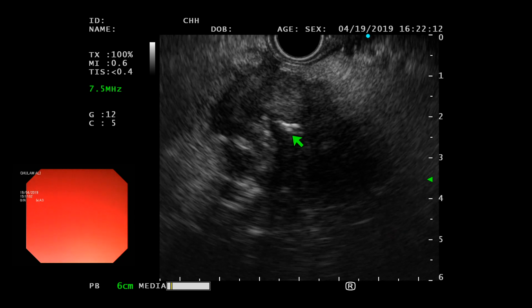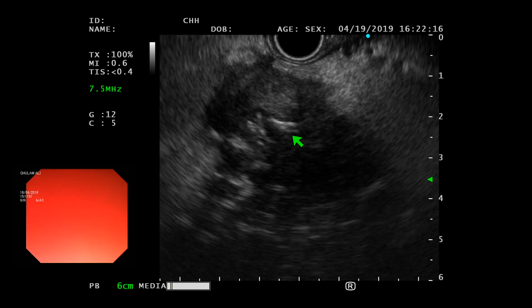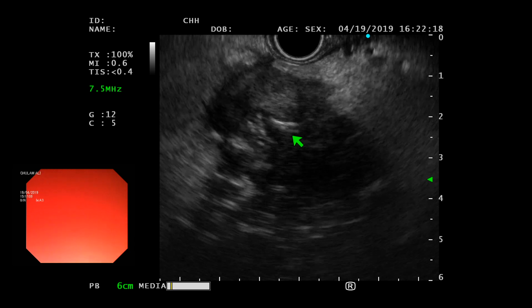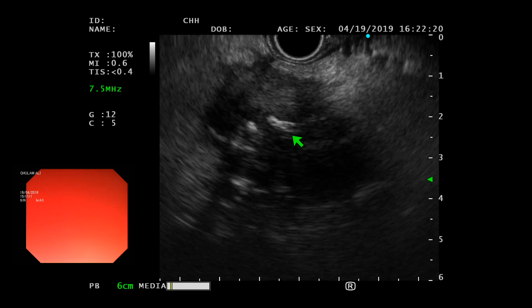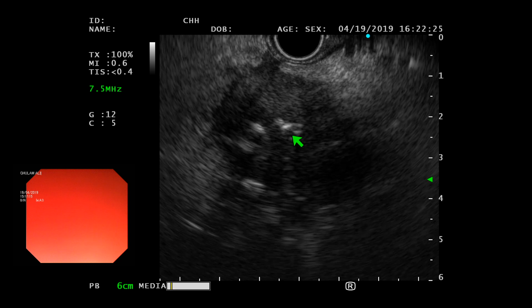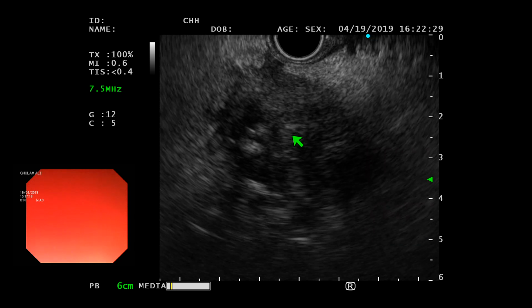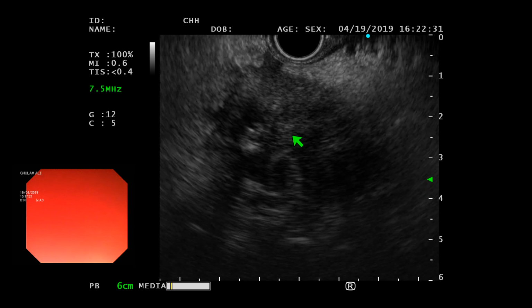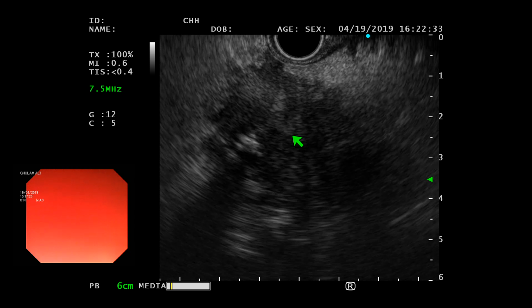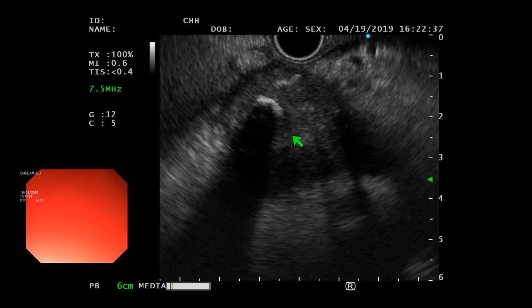It's all fat. Yes, all is fat. Fat looks clear. So here you see that they are facing towards me. Now you will rotate this, right? Rotate it and lift it up, and then 75 right there. Okay? So if they are facing me, then it's usually a 75% circumference and then it gets to you.